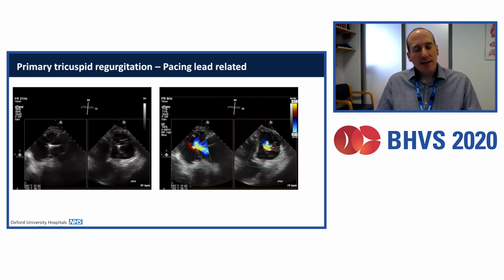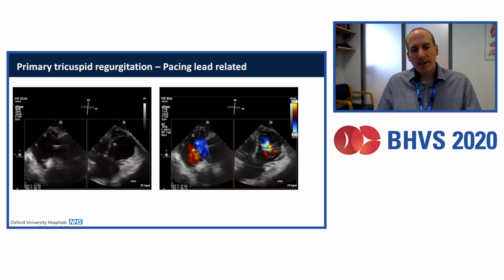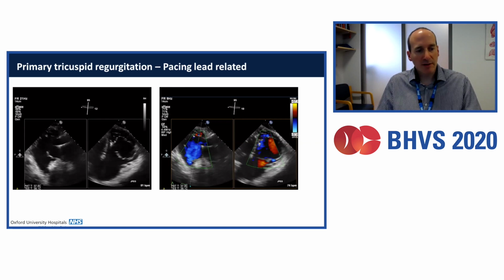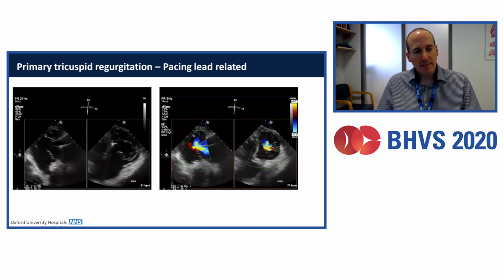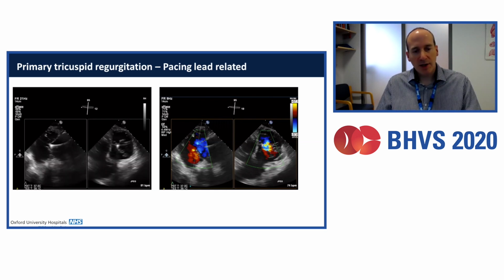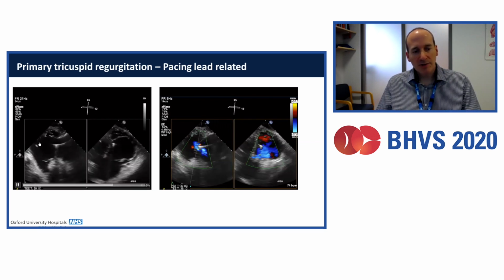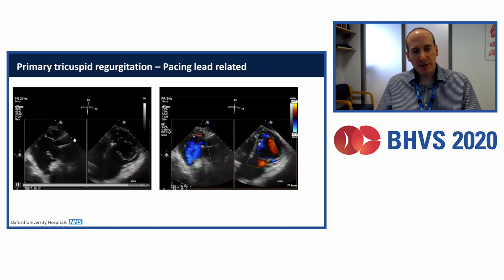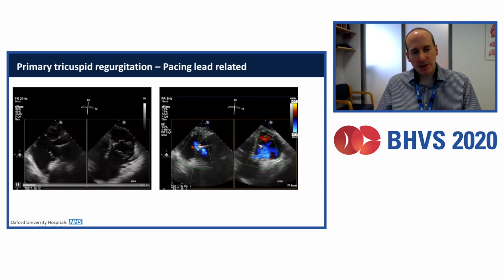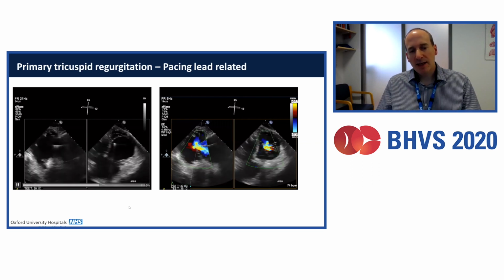This is an increasing problem for all of us in that we know a lot of pacing electrodes that traverse the tricuspid valve can impinge on the leaflets and cause entrapment. They can perforate the leaflets, they can entangle in the chordae, or they could disrupt the papillary muscles. And here's a patient with tricuspid regurgitation. This is often difficult to see clearly on echo, and you have to work hard to obtain a clear view, but I hope this transgastric long axis TOE image here on the left can persuade you that this right ventricular electrode of a dual chamber pacing system is impinging on the anterior leaflet and stopping coaptation with the posterior leaflet and leading to, as you can see, significant tricuspid regurgitation.